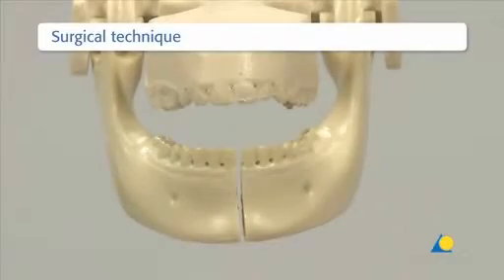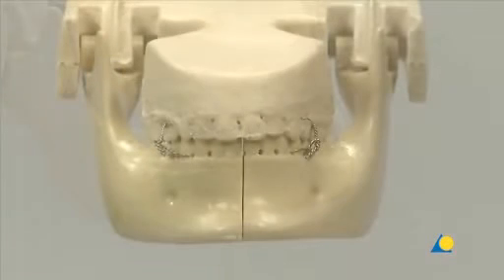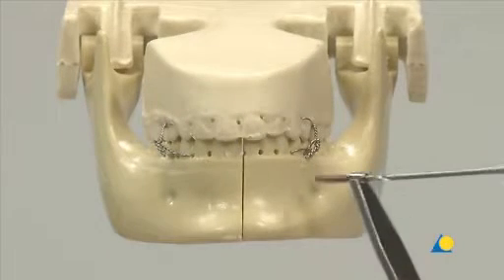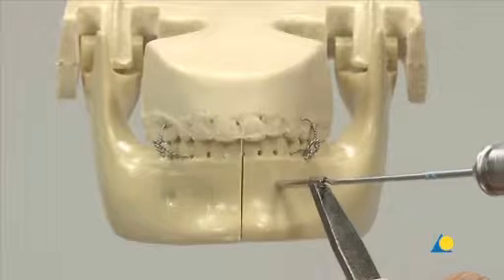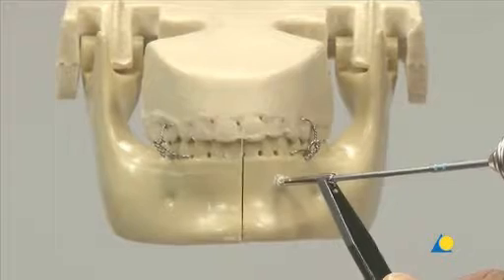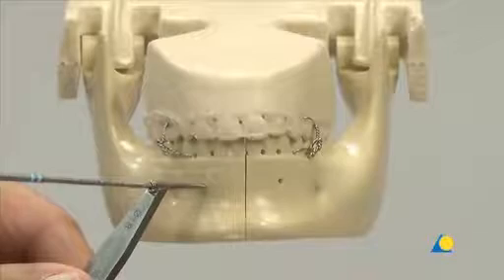Before open reduction and fixation in the dentate patient, the correct occlusion must be re-established. For this exercise, Ernst's ligatures have been selected to hold the occlusion. However, many surgeons prefer MMF with arch bars because of the increased stability. The model requires two monocortical holes to be drilled at the superior border on either side of the fracture to help when placing the reduction forceps. Caution should be taken not to harm the tooth roots, and the line connecting the holes should be perpendicular to the line of the fracture.